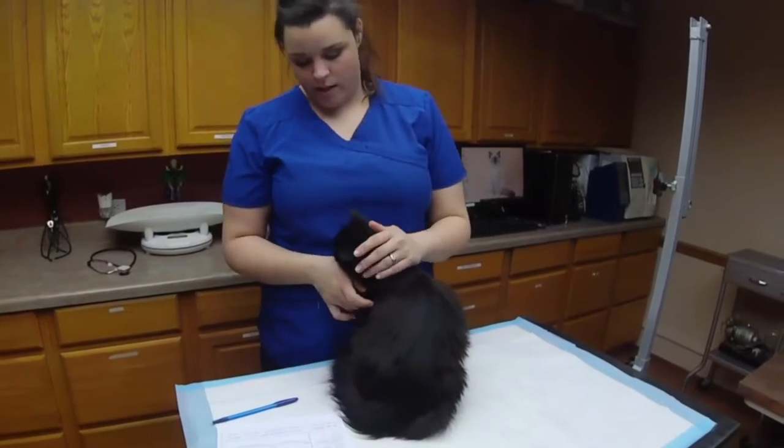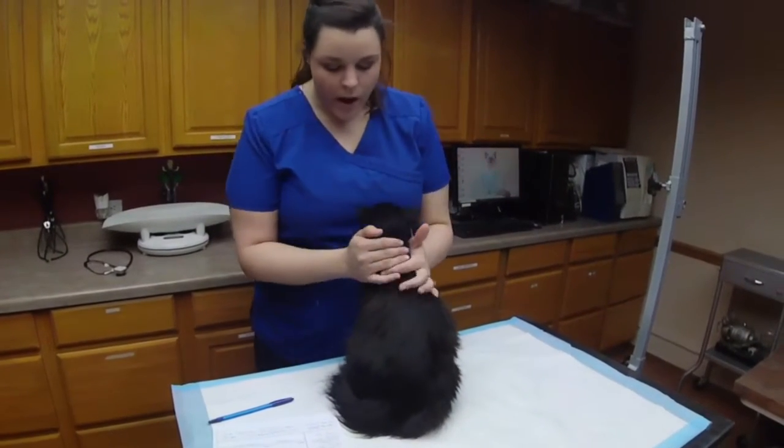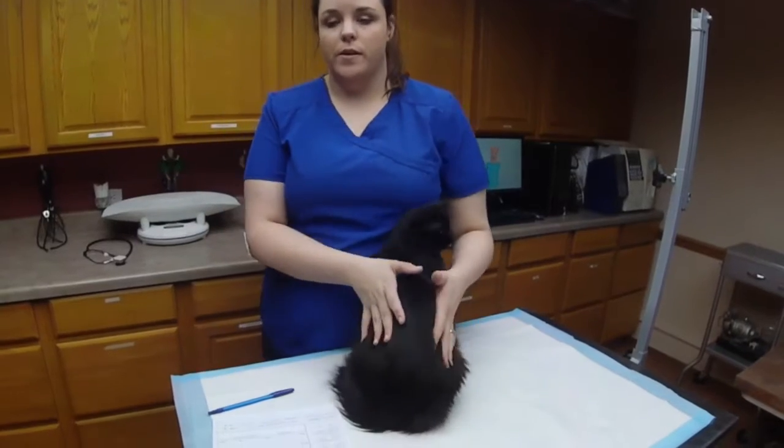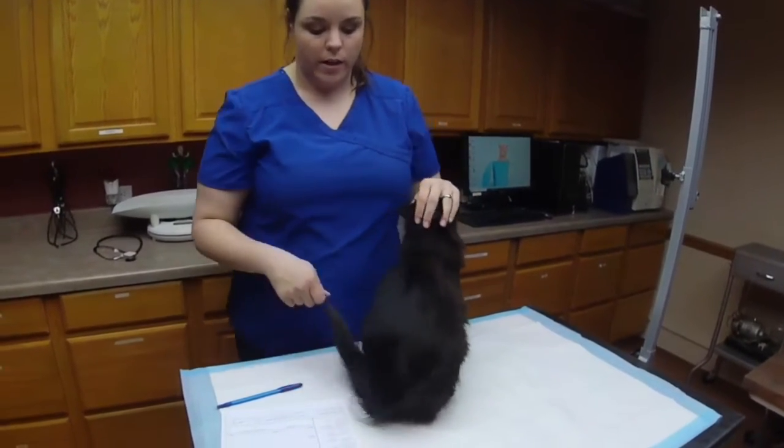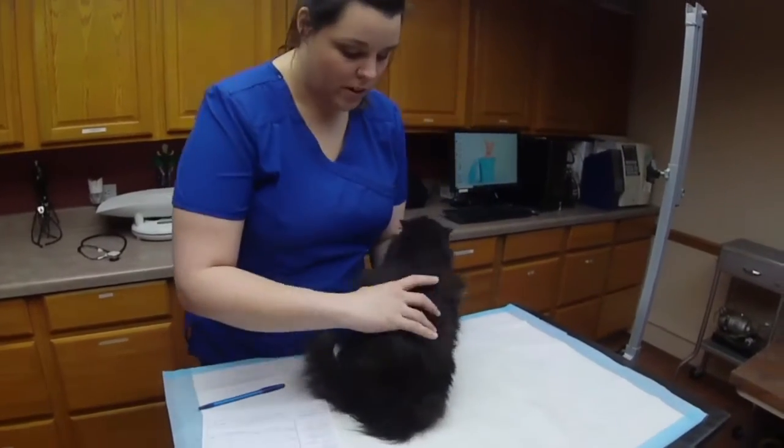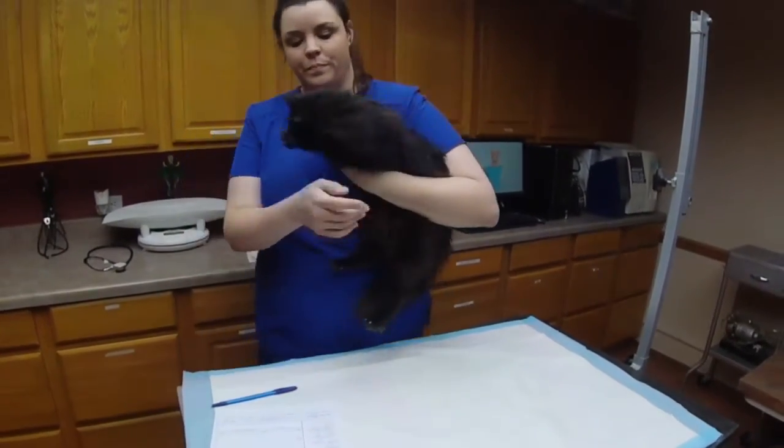I have Samara here ready for a physical. We are going to focus mainly on her temperature, her weight, and her respiratory count. We're going to start with her weight.